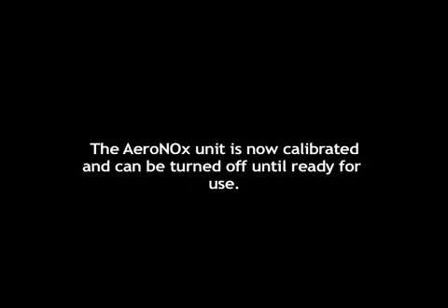The AeroNOx unit is now calibrated and ready for use. The unit may be turned off and stored until ready for use.